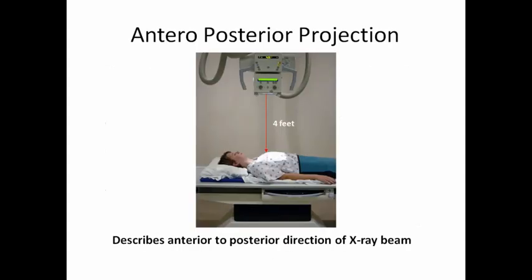We'll go with the patient positioning. The patient comes, the same procedure as I explained in chest X-ray PA view. Identify the patient, change in the dress, all the pre-procedure things. What will you do next step? You will ask the patient to lie down in supine positioning. Both arms will be kept aside on both sides of the patient to avoid overlap on the chest. The mid sagittal line will be perpendicular to the table. Mid coronal line will be parallel to the table.